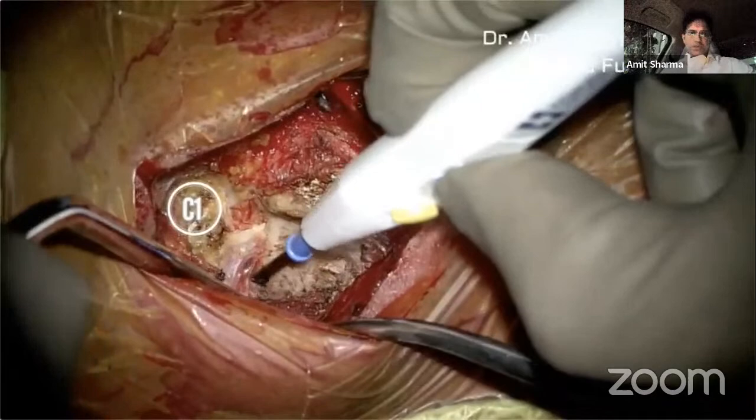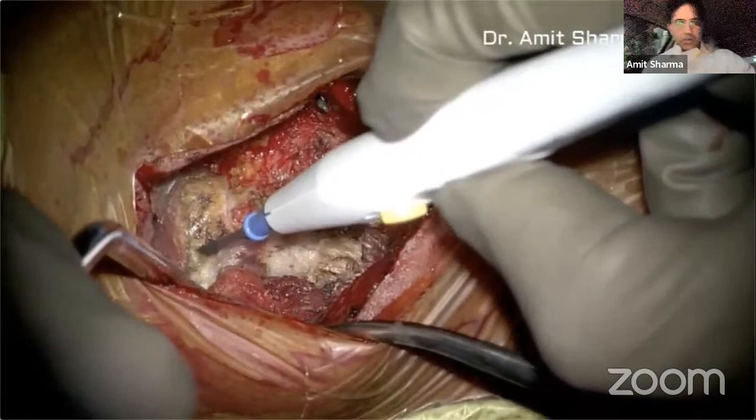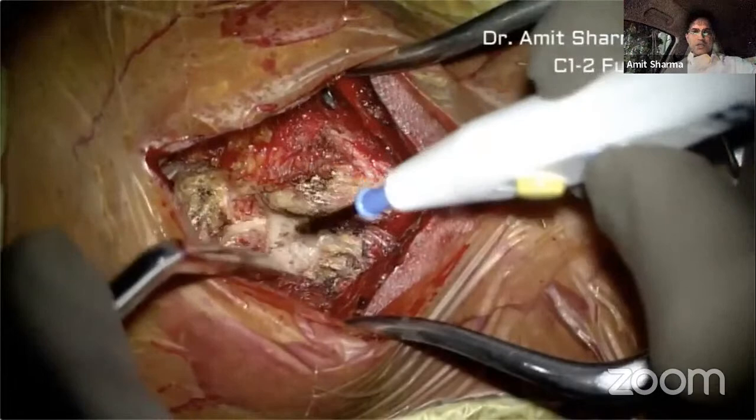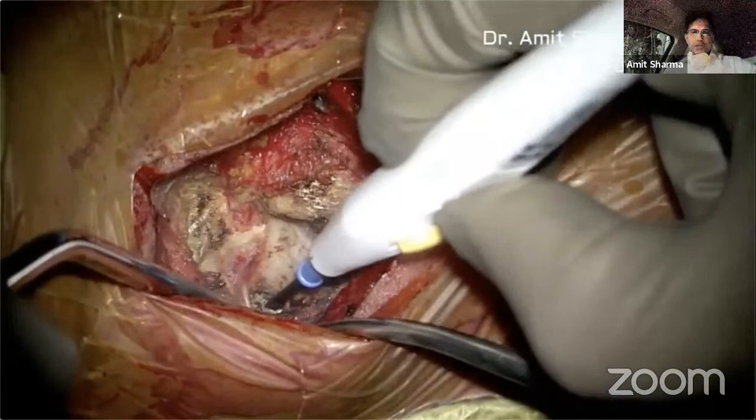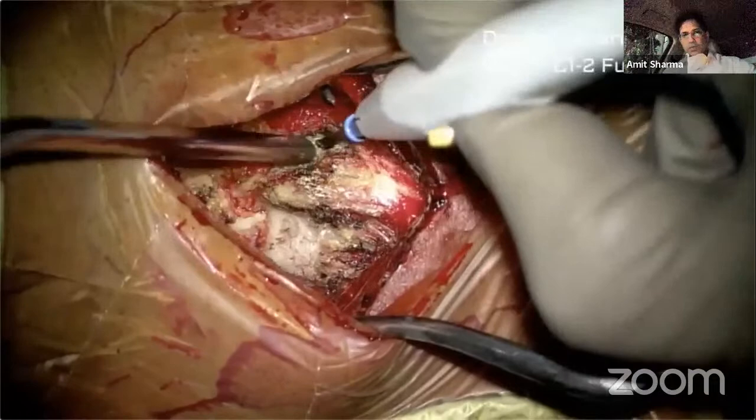One of the biggest problems we face during this surgery is the heavy bleeding we encounter from the C1-C2 joint. This obviously is an edited video, so we will not be seeing much of the bleeding, but that's the only problem we face with this surgery. Once you start exposing the C1-C2 joint area and the C2 nerve root, you will have a lot of bleeding, and you need to expose that area to insert your C1 lateral mass screw. So after the dissection on the left side, we are proceeding with the dissection on the right side.